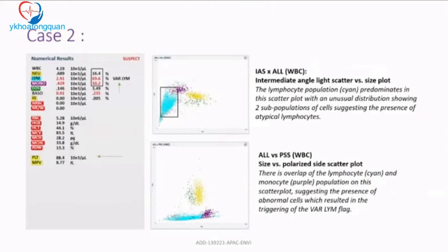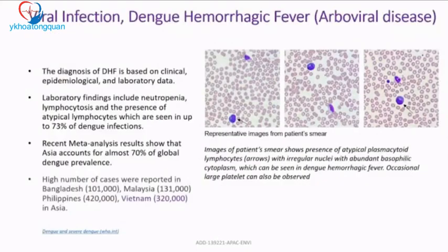In the PSS plot — size versus polarized side scatter — there is an overlap of the lymphocyte (blue) and monocyte (purple) populations, suggesting abnormal cells and triggering the lymphocyte variation flag. When you receive a flag on a hemogram printout from a six-part differential analyzer, please take it very seriously.